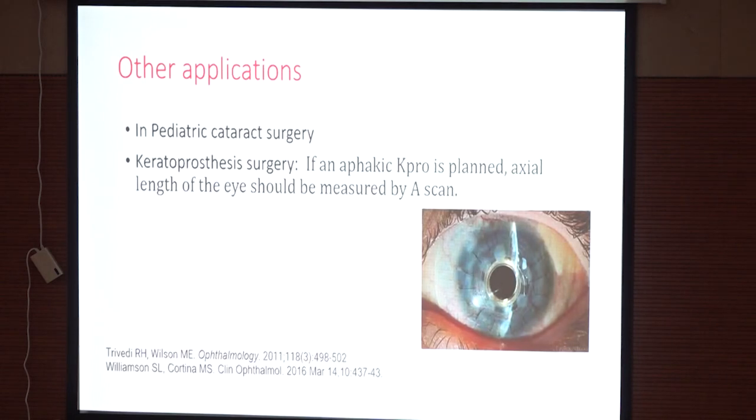There are other applications of A scan as well. It's used in pediatric cataract surgery, in keratoprosthesis surgery. If an aphakic K-pro is being planned, the axial length of the eye is measured by an A scan.